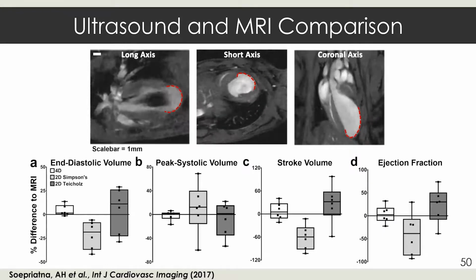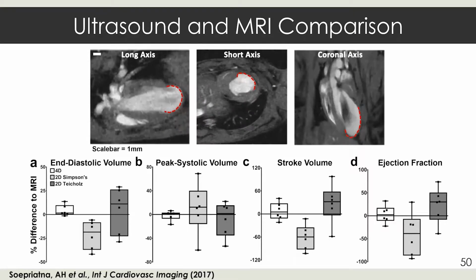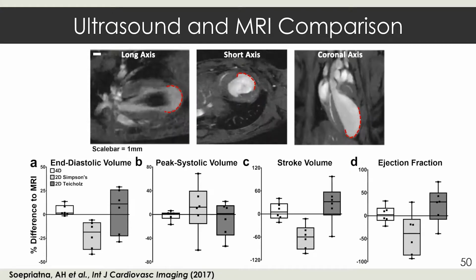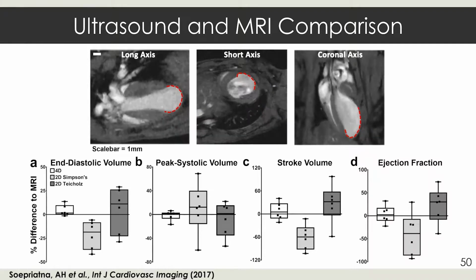So you shouldn't think about doing acquisitions where you are necessarily doing the 50 micron steps if you don't necessarily need that. That's going to take a lot longer, and you probably won't actually use that data. You use every other or every third slice when you're doing the segmentations. So we're definitely not having to go back and find the exact same location each time with this volumetric approach. It absolutely helps with repeatability, where we can go back and collect a whole new volume. And even if it's at a slightly different angle and a slightly different starting point or ending point, we can get similar data and similar results from it.